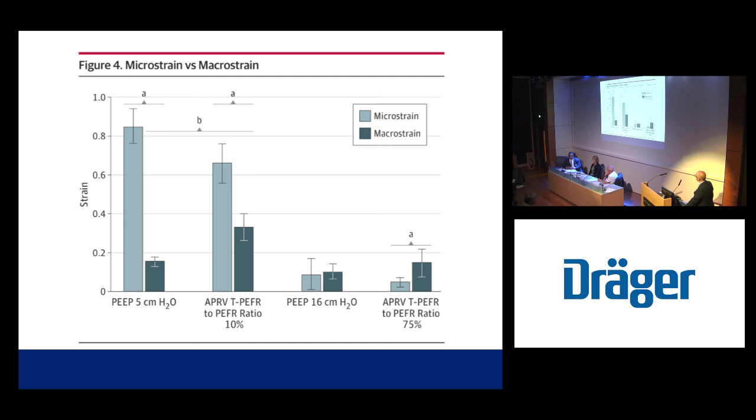And so perhaps in ventilation, we're still at that same concept, that we need to extend beyond the ventilator with whatever technique. I think this morning's session was good because we discussed a bunch of other opportunities, even stuff that's available right now, to explore a greater understanding of what's actually happening rather than just tidal volume in, tidal volume out. Did you want to say anything about this?